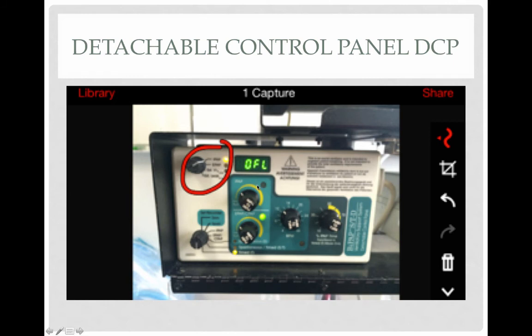So here is the IPAP control that's going to set that inspiratory pressure that's activated depending on what mode you're in. This control here is going to set your EPAP pressure. This sets your breaths per minute, and this sets your IPAP percent. And this is somewhat color coordinated. So when we're in the CPAP mode, we're only going to set this EPAP CPAP knob. Then we have a spontaneous mode. In the spontaneous mode, we would set all variables in this lighter green area, which is just IPAP and EPAP.